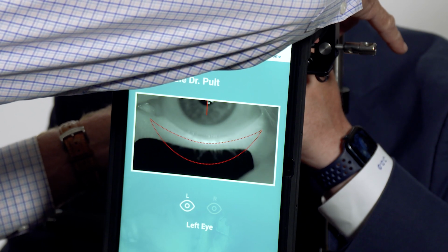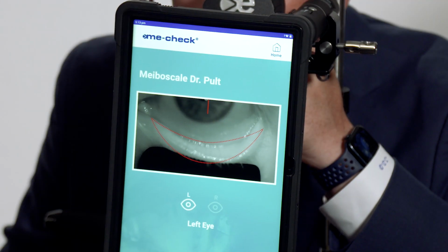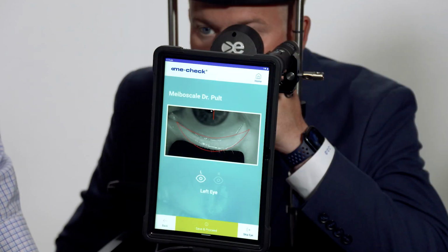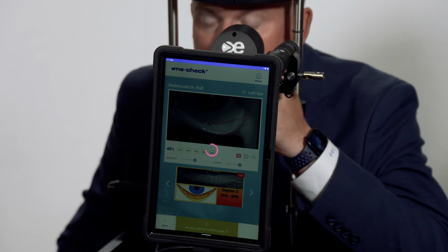Sometimes you have to actually get it to where you say, I want you to hold it right there, don't move it. And so what I did is I moved it to where I got the placement the way I liked it and hit save and proceed.